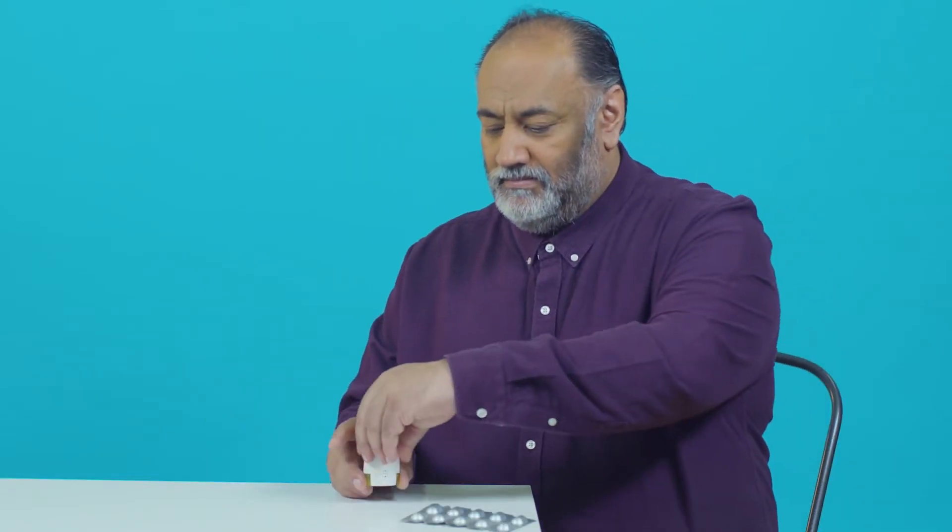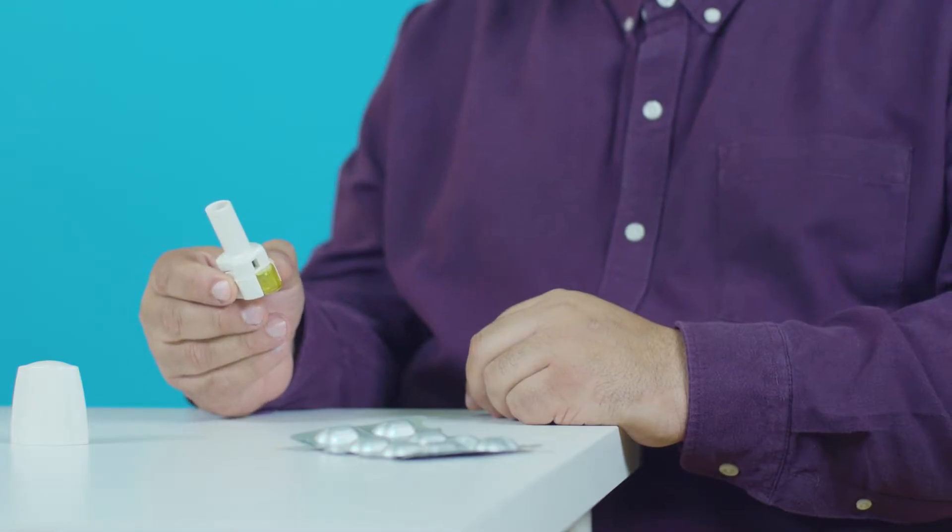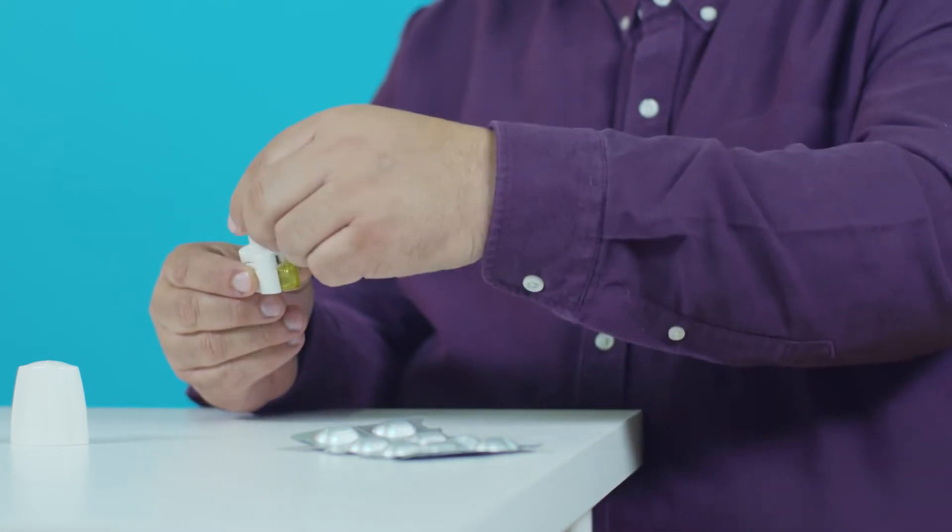To use your inhaler, first take the cap off. Check there's nothing inside the mouthpiece. Open the inhaler by pushing the mouthpiece back.